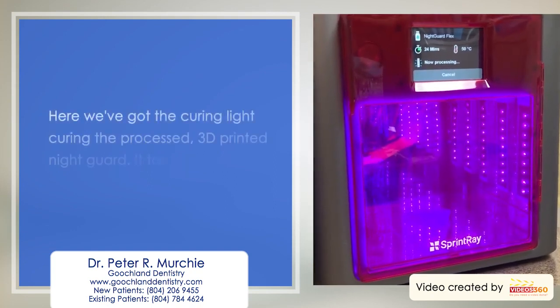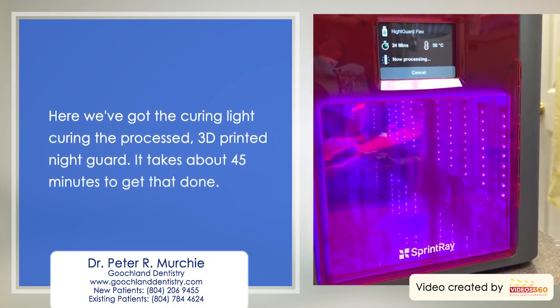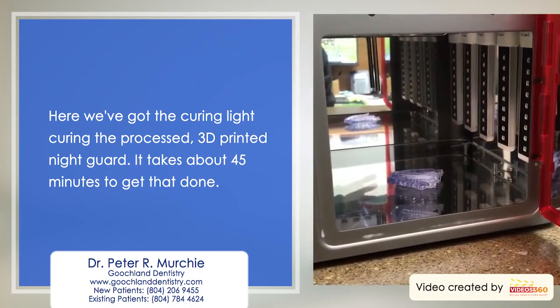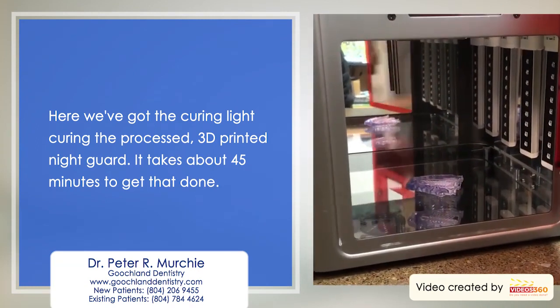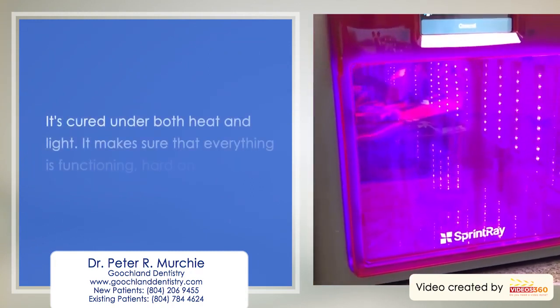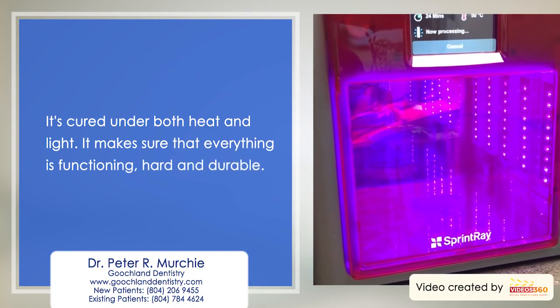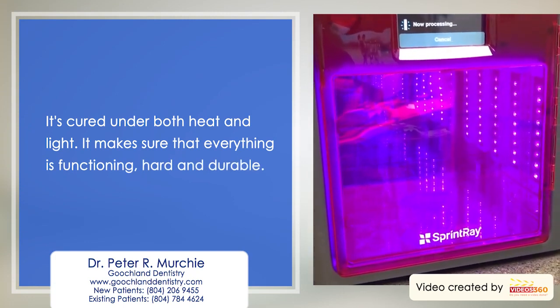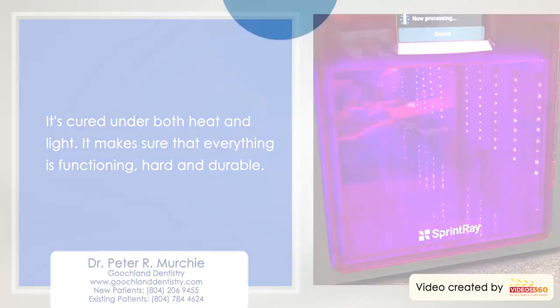Alright, so what we've got here is the curing light that is curing the processed 3D printed night guard. And it's pretty cool. It takes about 45 minutes to get that done. It's done under both heat and light, and it makes sure that everything is functioning and is very hard and durable.